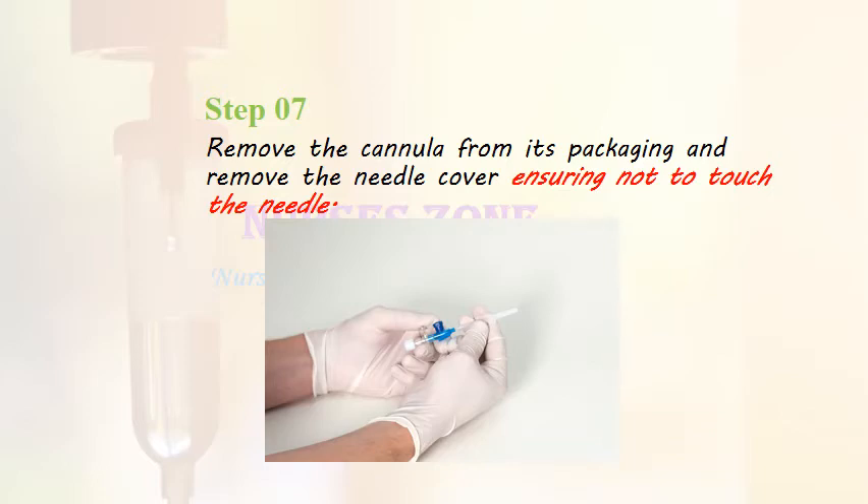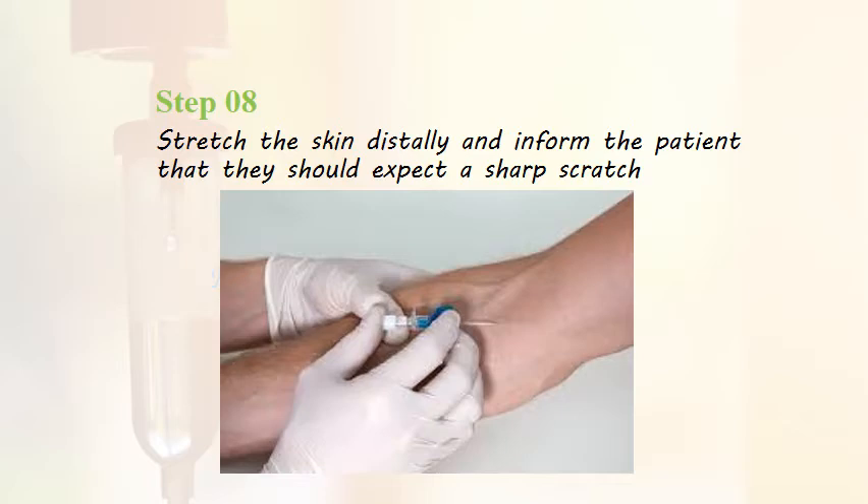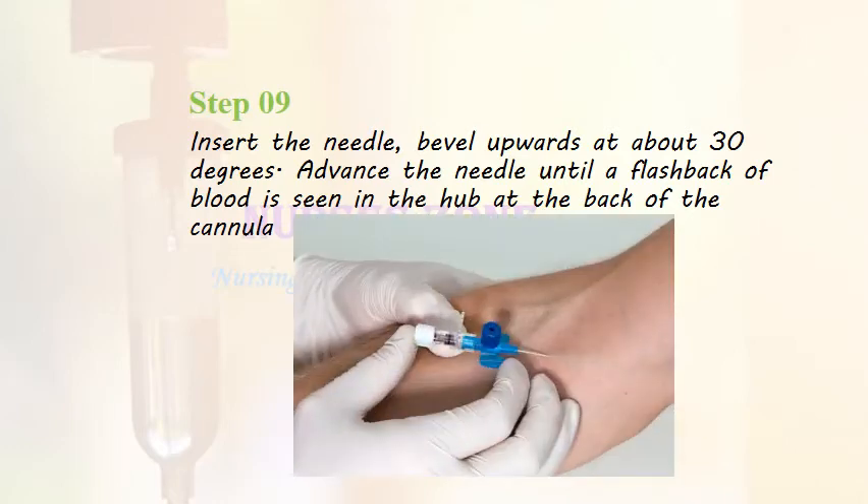Step 7: Remove the cannula from the packaging and remove the needle cover, ensuring not to touch the needle. Step 8: Stretch the skin distally and inform the client that they should expect a sharp scratch. Step 9: Insert the needle bevel upwards at about 30 degrees. Step 10: Advance the needle until a flashback of blood is seen in the hub at the back of the cannula.